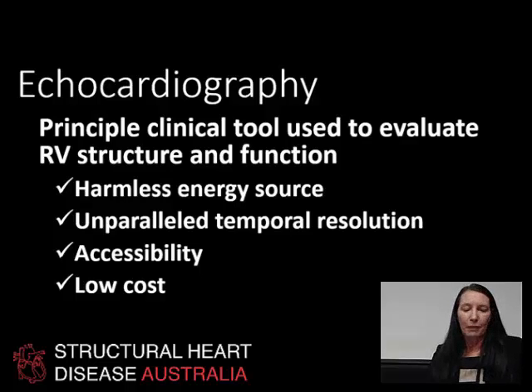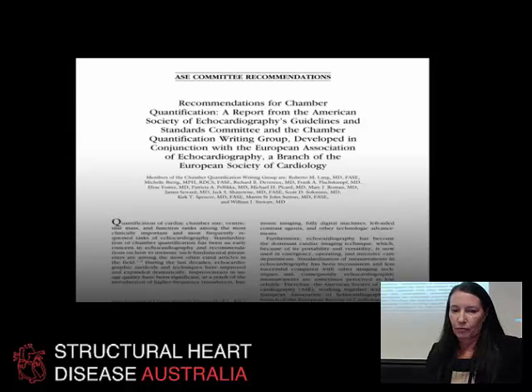I think we'll hear a little bit more about MRI later in the morning and how good it really is, and I'm not turning it down too much. But echo is our workhorse, and this is what we need to use to actually assess the right ventricle on a serial basis.